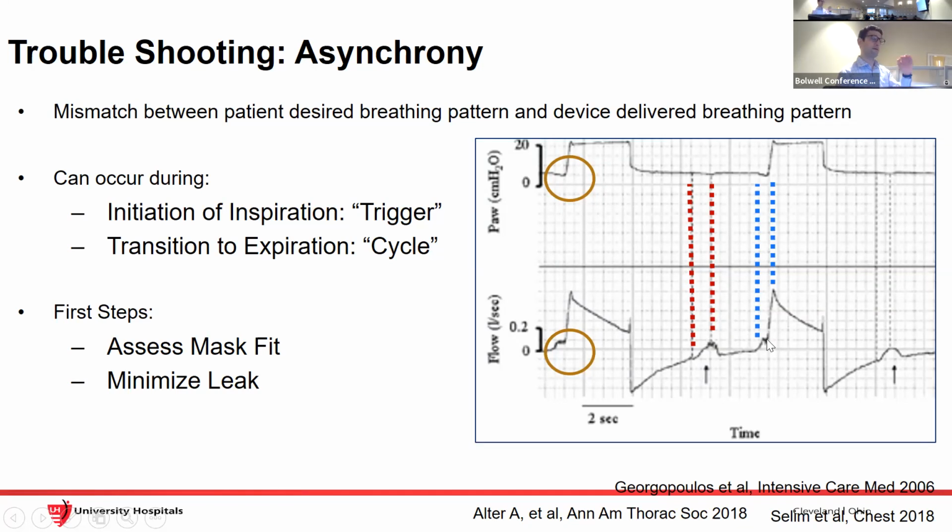That hit the line, and so that causes an increase in flow and an IPAP breath. And then again, another missed trigger. When you look at studies with neuromuscular patients, I look at the flow, but I also look at their abdomen. How many times is their diaphragm moving? And then how many times is actually a breath being delivered? That's another way to ask how well they are syncing with the breath.